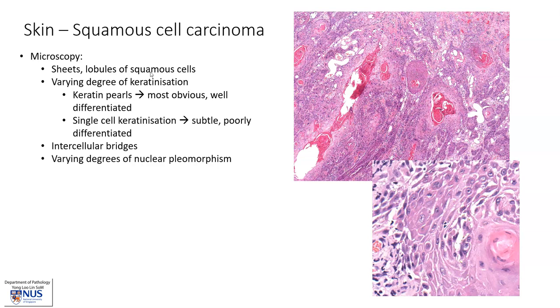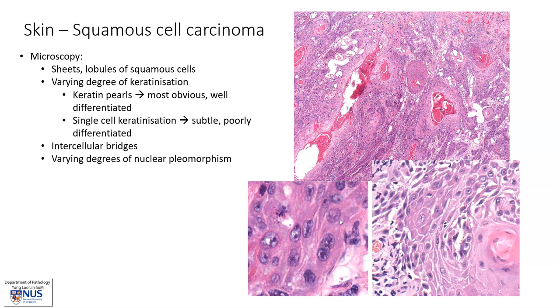Microscopically, squamous cell carcinoma is composed of sheets or lobules of neoplastic squamous cells showing varying degrees of keratinization. Keratin pearls are the most obvious signs of keratinization, and if you see many of them, the tumor is generally well differentiated. We also saw single cell keratinization — if we only see this, the tumor is likely more poorly differentiated. We also saw the intercellular bridges between adjacent cells, which is a feature of squamous differentiation. Intercellular bridges can also be seen in benign squamous epithelium, so they are not specific to squamous cell carcinoma, but rather indicate squamous differentiation.